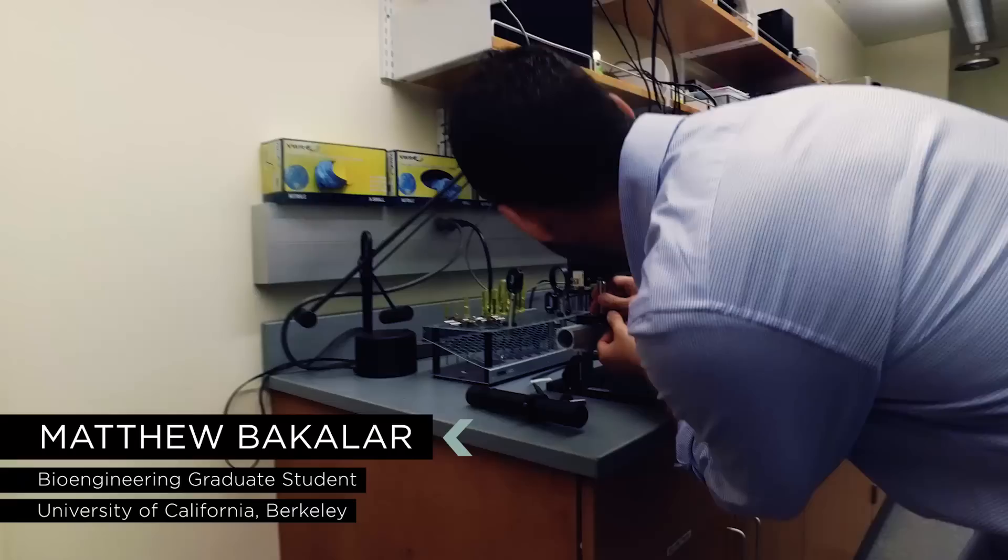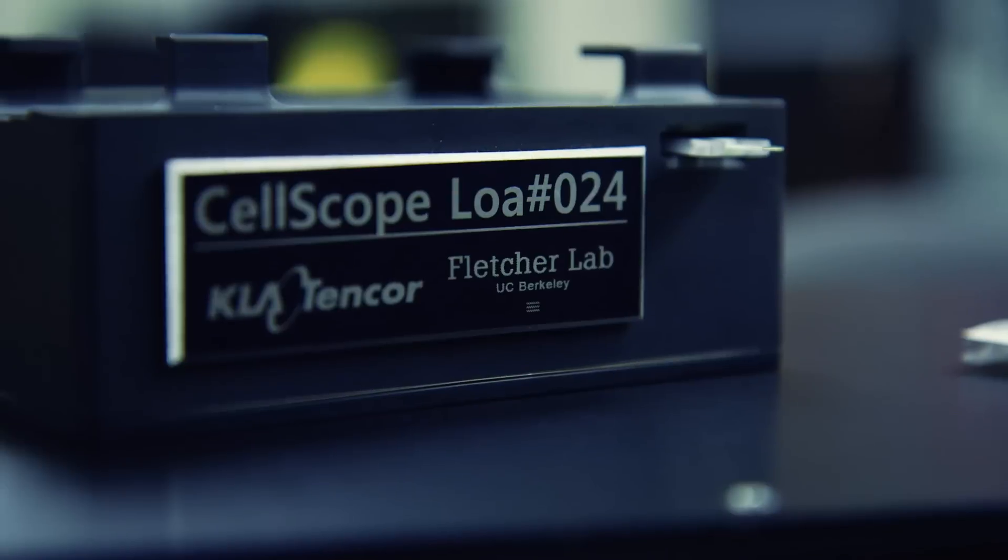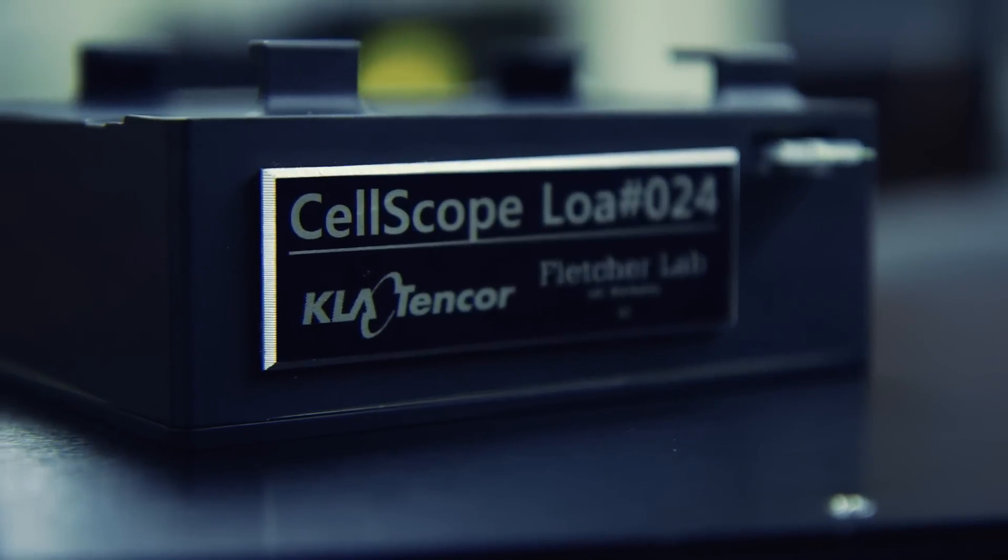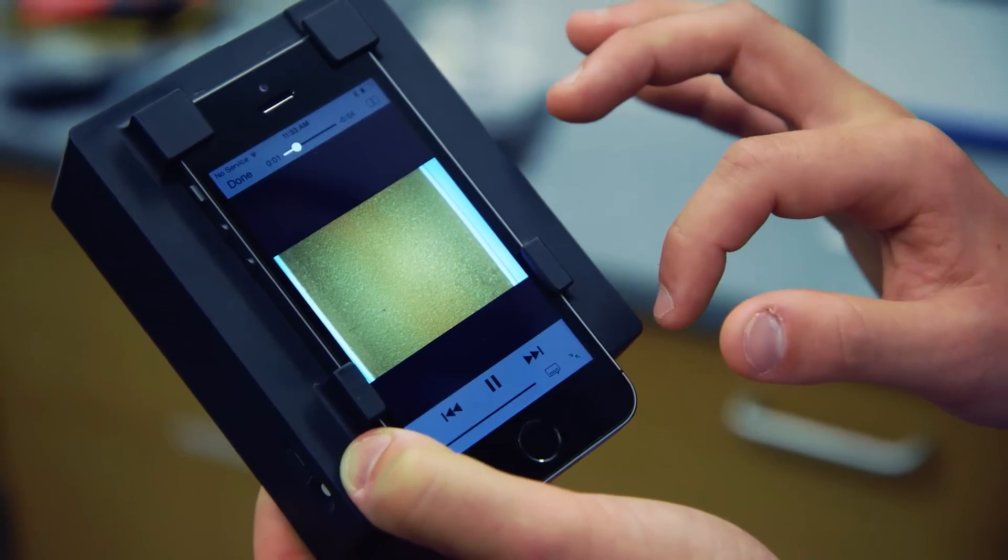But that could all change thanks to a modified piece of tech that we already know and love. We build microscopes that are based around a cell phone. That's Matt Bacalar, a bioengineering Ph.D. student at the University of California, Berkeley. He's part of a project team that's been working on the CellScope Loa, an optical device that converts a cell phone's camera into an inexpensive handheld microscope.